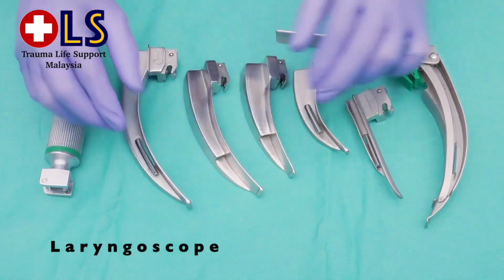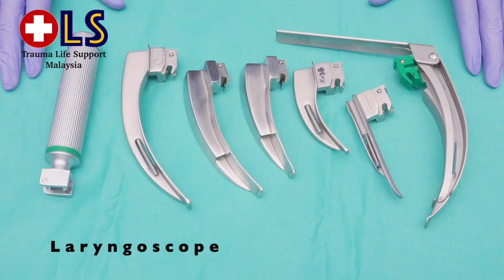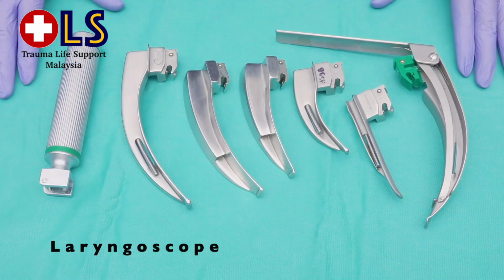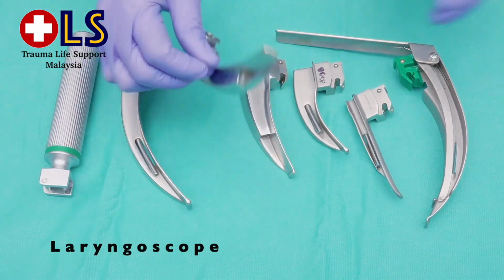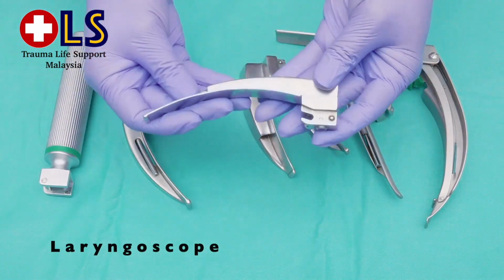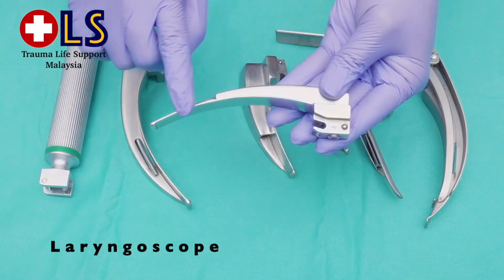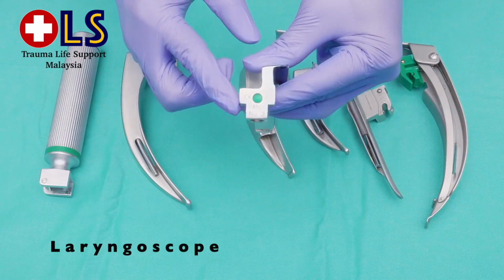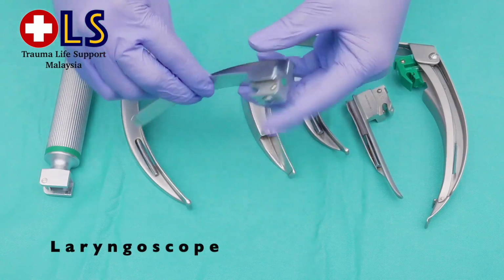This is important as you might need the short handle laryngoscope on patients with short neck, big chested or barrel chest. The blade comes in a few types and sizes. Commonly used is the curved blade, known as Macintosh. The common size for adults: for female, size 3, and for male, size 4.